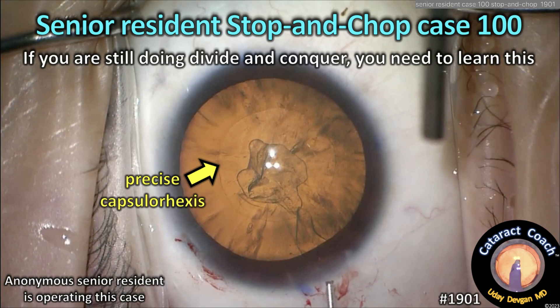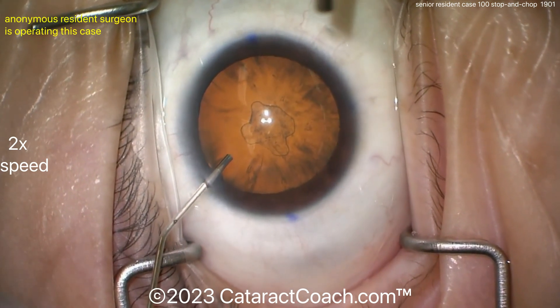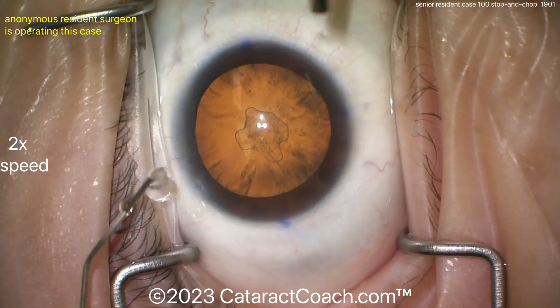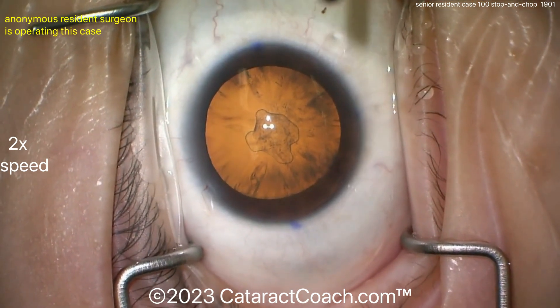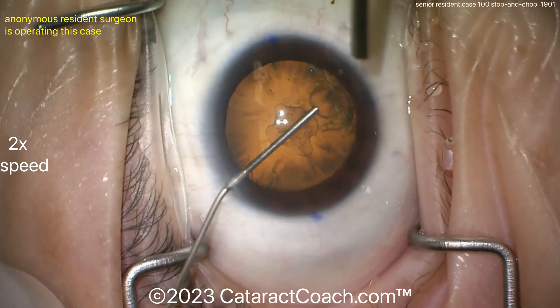Cataractcoach.com — senior resident stop-and-chop at about case 100. If you're still doing divide and conquer, you need to learn this. This is a resident case around case 100 to show you what can be accomplished with some hard work. The video is shown at two times normal speed, so it takes about seven minutes, meaning the total unedited case time is around 14 minutes.